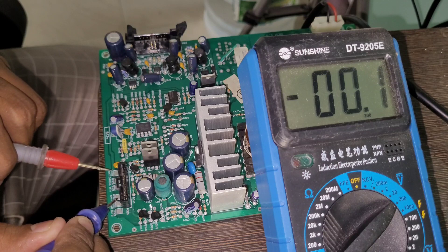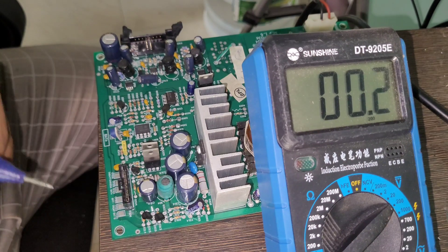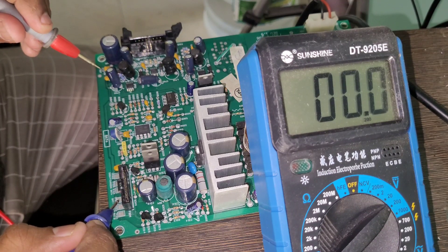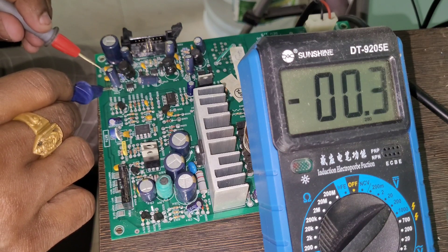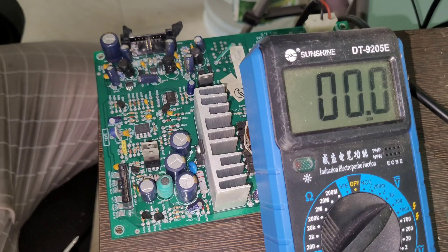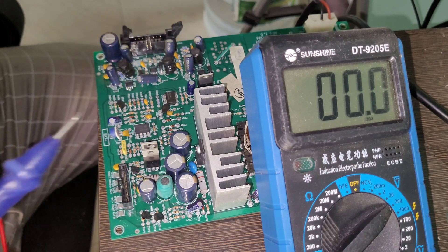Checking other test points: getting about 0.6, 0.5. Let's check the plus 5 volt — not getting it. And minus 8 volt — we are not getting that either. So we can assume this side of the circuit is having a problem.